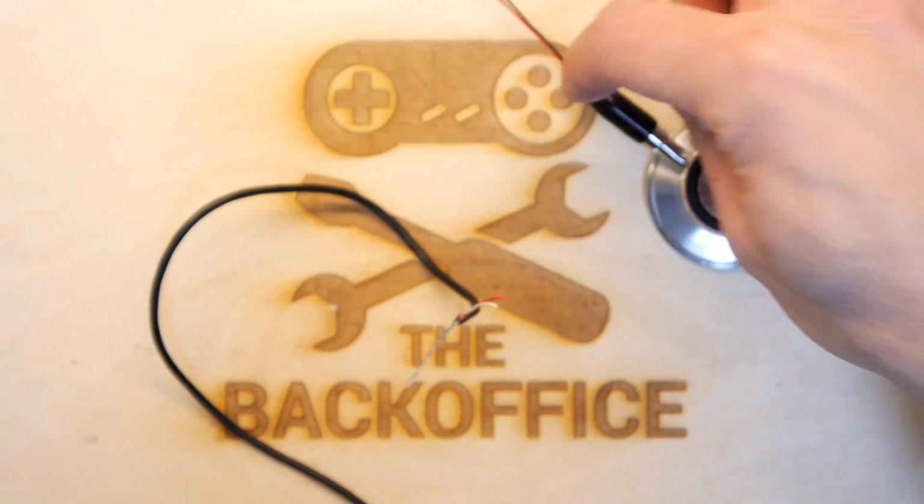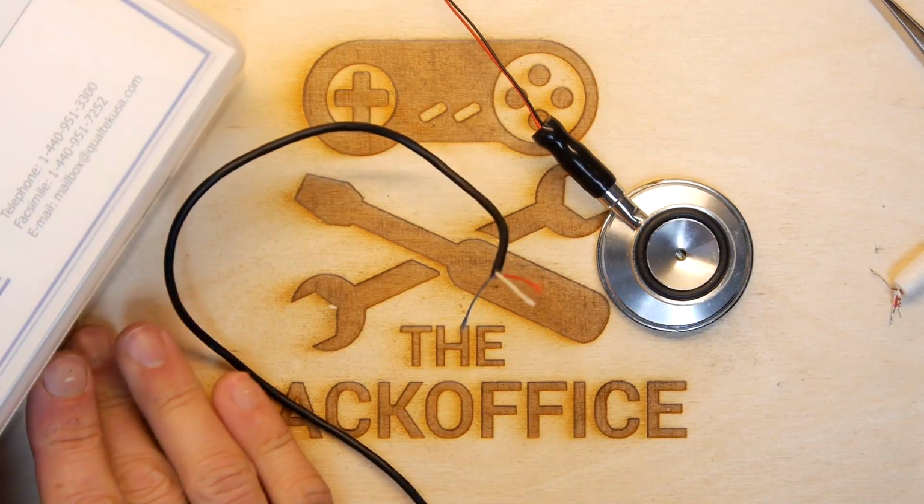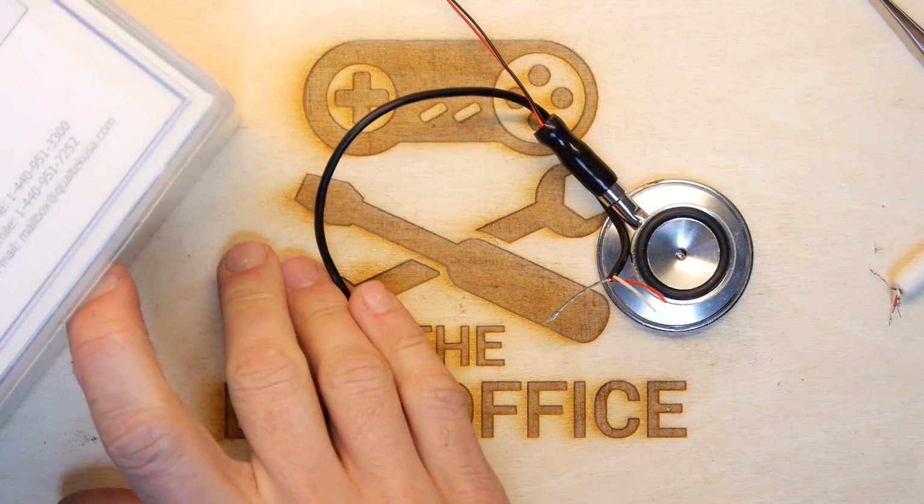And that's what we're going to be soldering in there. But before I solder anything, I need to get some heat shrink. So you can use heat shrink or you can use tape, depending on what you've got. I've got a big old box of it.